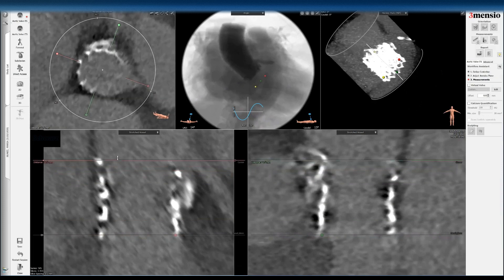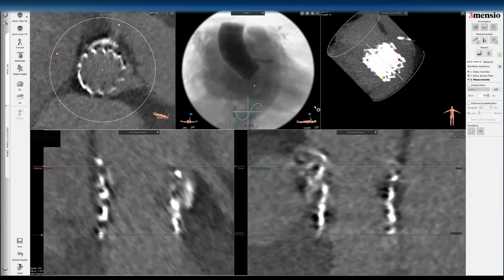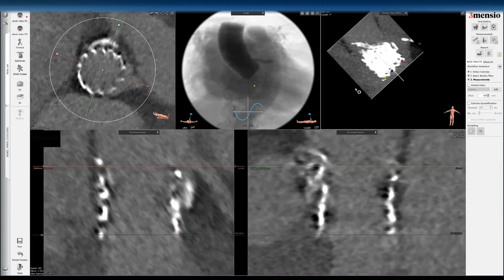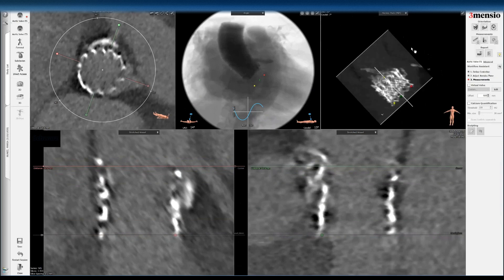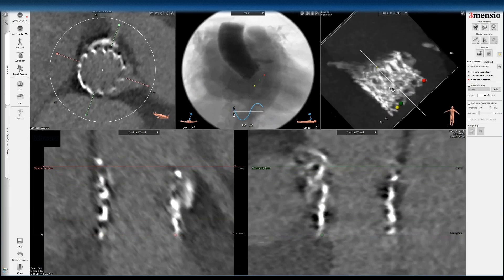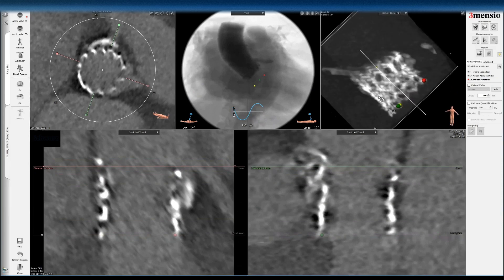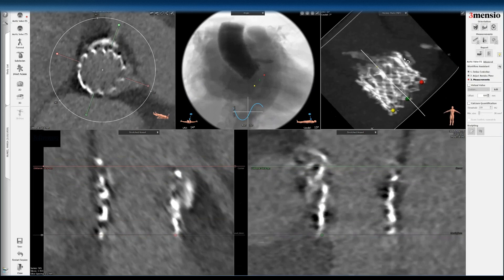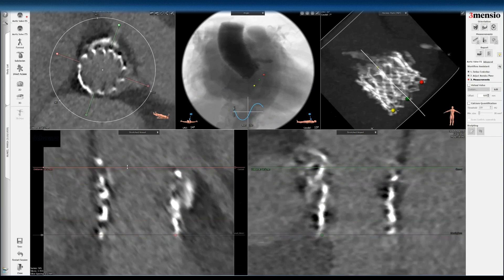If I drop the gain on the top right view so you can see the frame metal better, you can see the frame is actually asymmetrically expanded — part of the frame is a little taller than the side facing the left main. So this measurement is an estimate, not a true height of the transcatheter valve, because it depends on which side you measure.